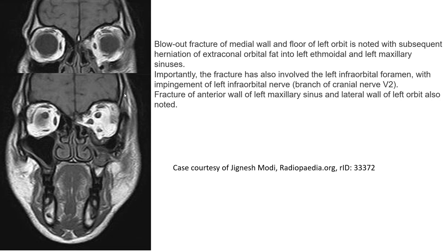Importantly, the fracture has also involved the left infraorbital foramen with impingement of the left infraorbital nerve. Fracture of the anterior wall of the left maxillary sinus and lateral wall of the left orbit are also noted.